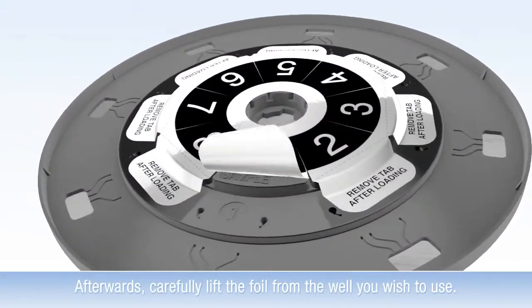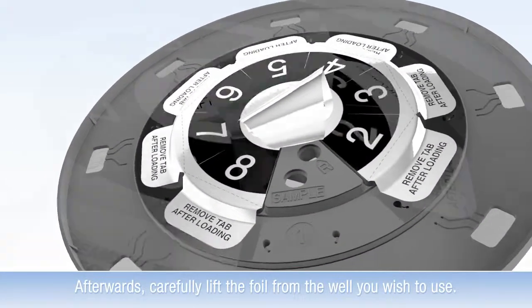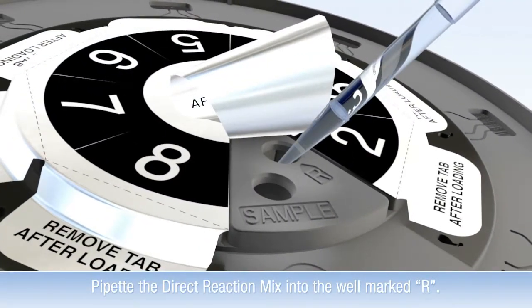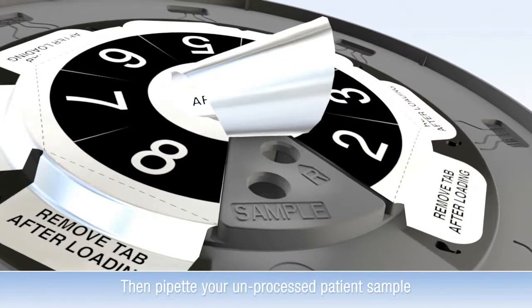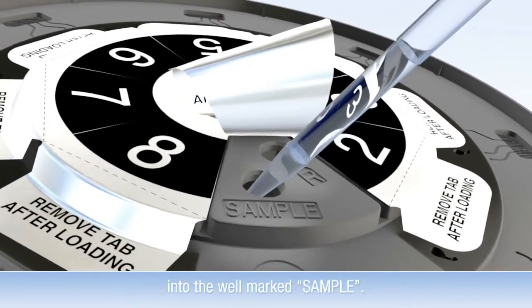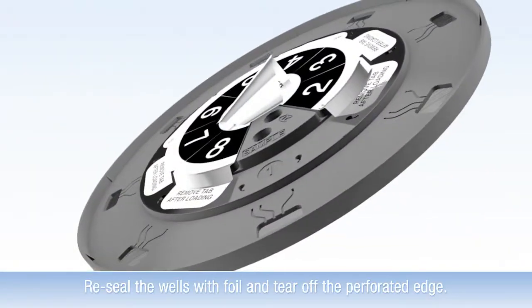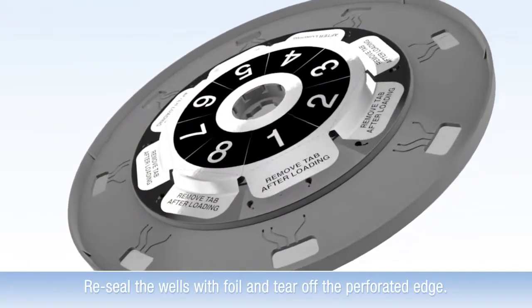Afterwards, carefully lift the foil from the well you wish to use. Pipet the direct reaction mix into the well marked R. Then, pipet your unprocessed patient sample into the well marked Sample. Reseal the wells with foil and tear off the perforated edge.